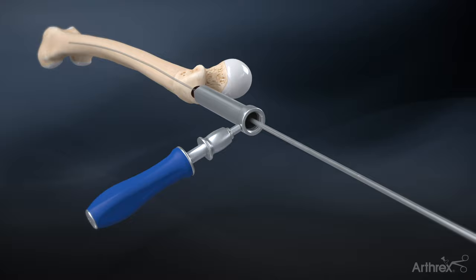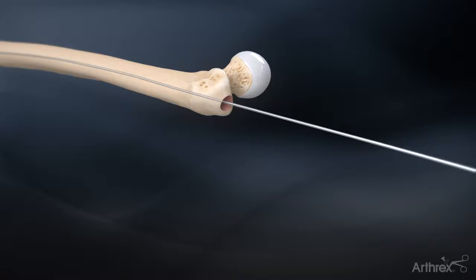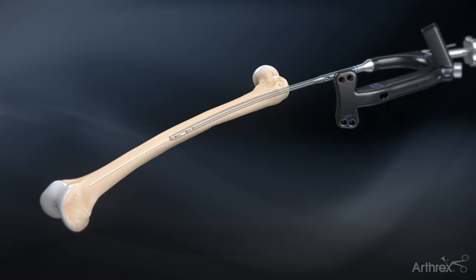Ream 1 to 1.5 mm over desired nail diameter. Introduce the nail into the femur over the ball nose guide wire.